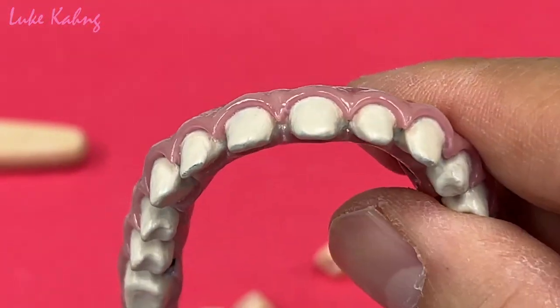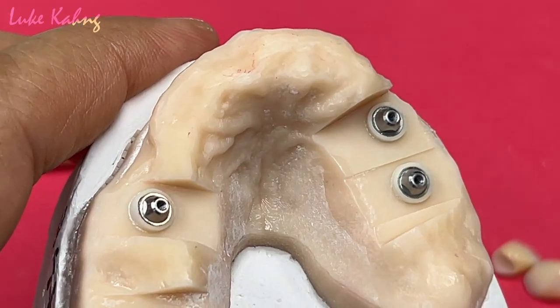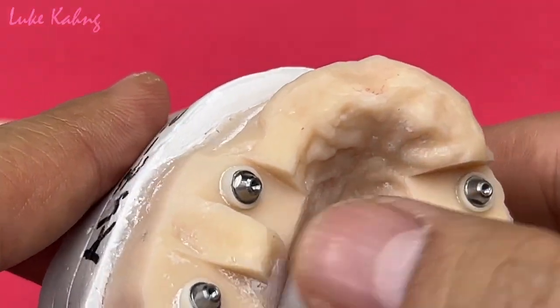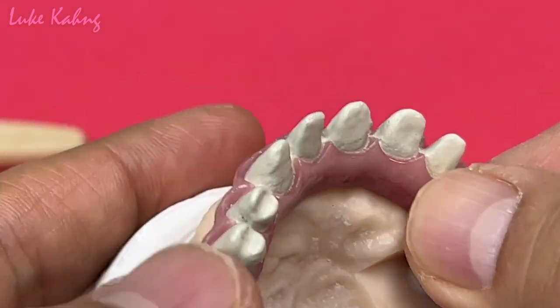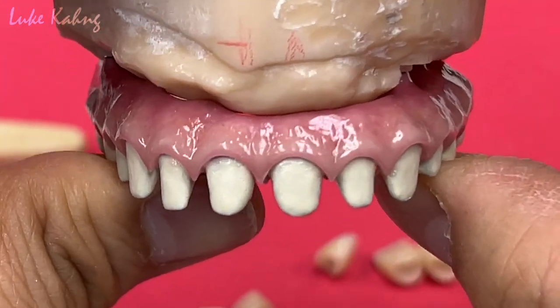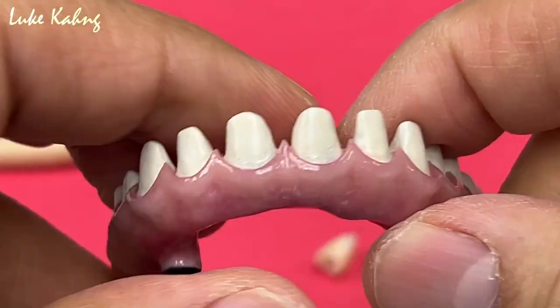So previously, we prepared the model, and then this one actually I sent it out. I tried it in, just to make sure it all fitted, because this is from the STL file. We just trim it, the span, and then make sure it all fits. Okay, so underneath is fitting the implant, everything is right. That's number one. Okay, that's what we can do.